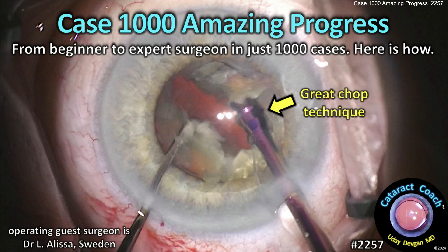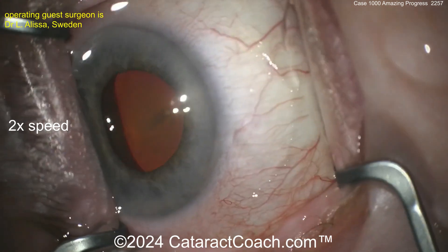CataractCoach.com, Case 1000 — amazing progress. From beginner to expert surgeon in just a thousand cases. Here's how it's done.